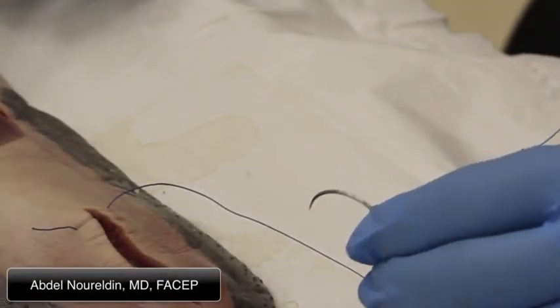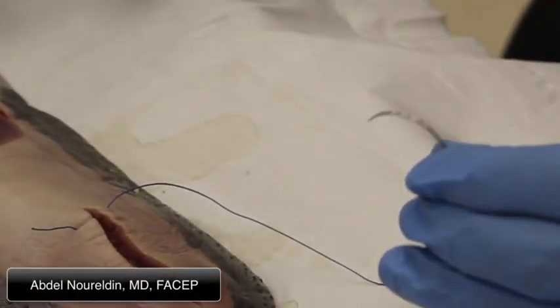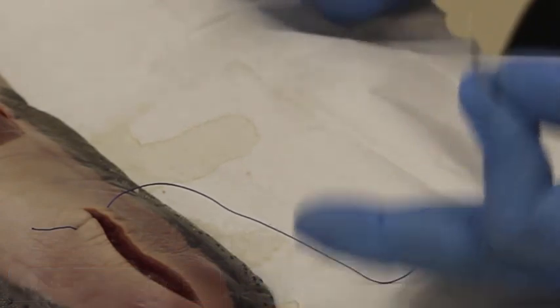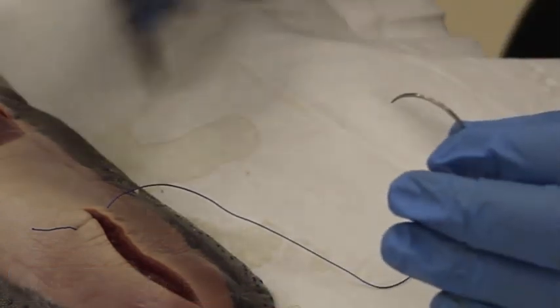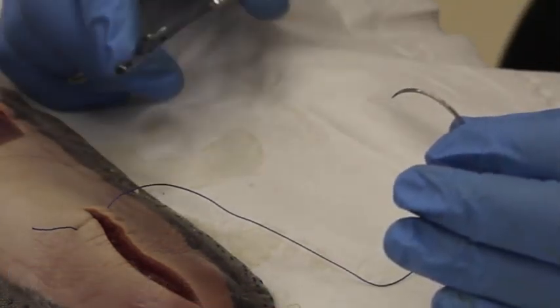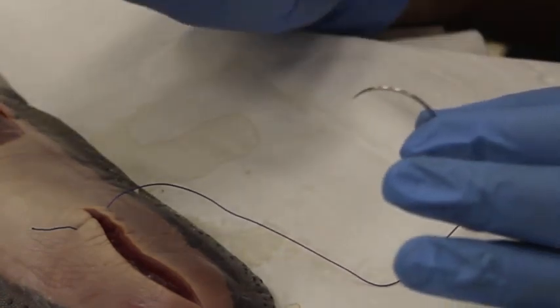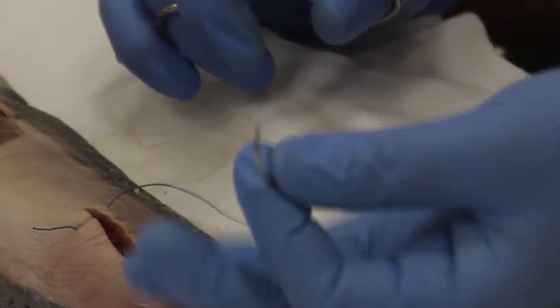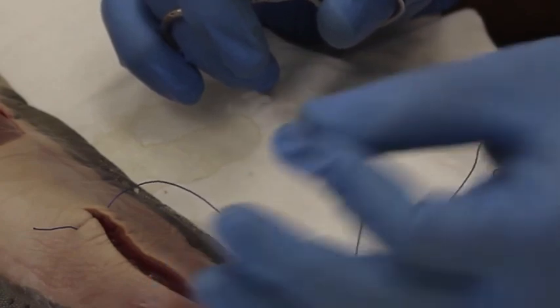Okay, now we're going to show you how to hold the needle and how to hold the suture in your hand after you put the needle through. The needle has only two places: on the needle holder or the driver, or between your fingers. I picked a big needle so you can see it.